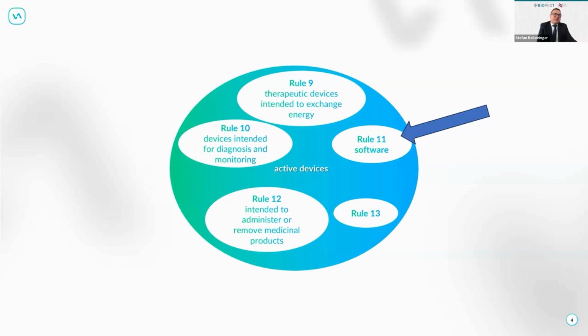Once it is used for patient-specific data to calculate for the benefit of that patient, then it becomes a medical device, because then it does diagnosis, therapeutic decisions, or other pathways or other information, like therapeutic decisions or patient management or predictions. In those cases, that will work as well.